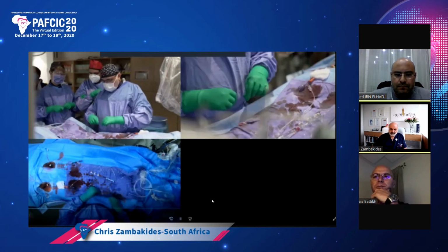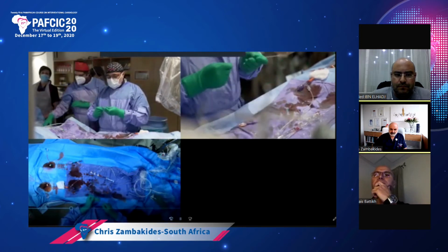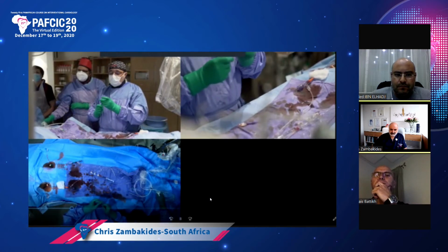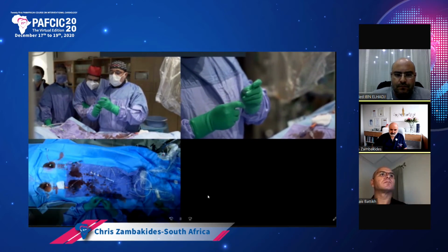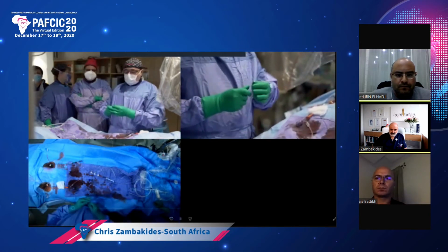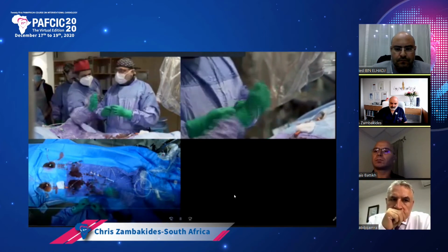Okay, so the good thing with this now is you can just give it a little primary bend, and a very small little secondary bend. So essentially, I think he's got it, yeah.